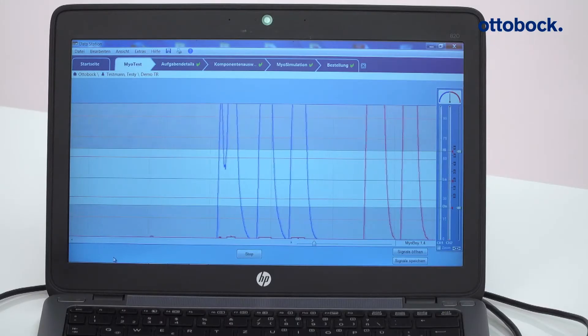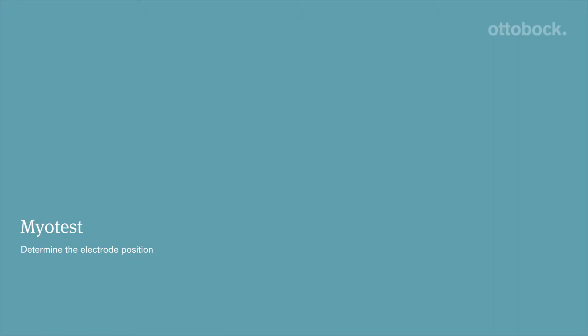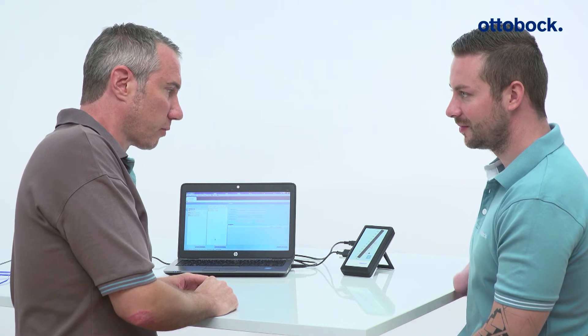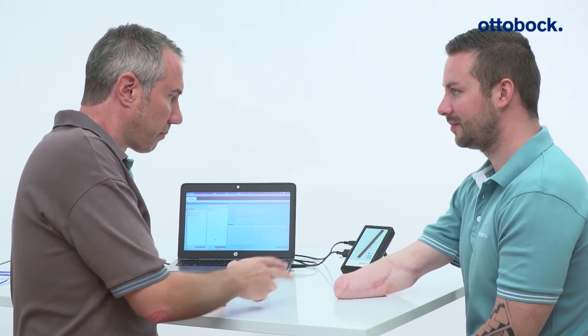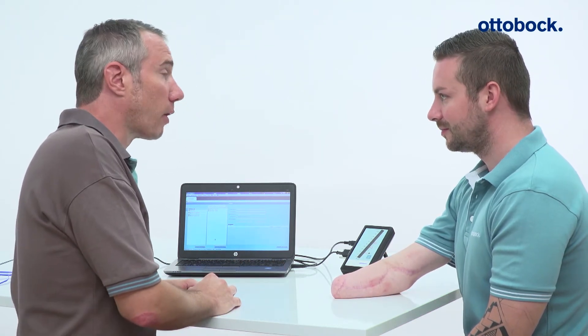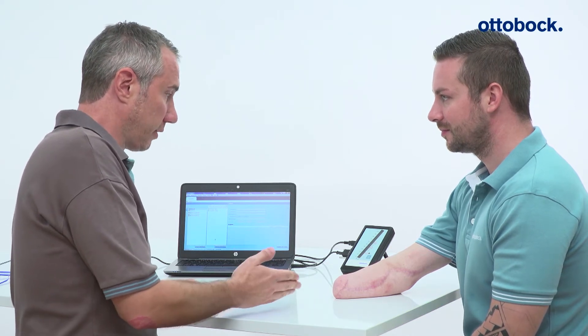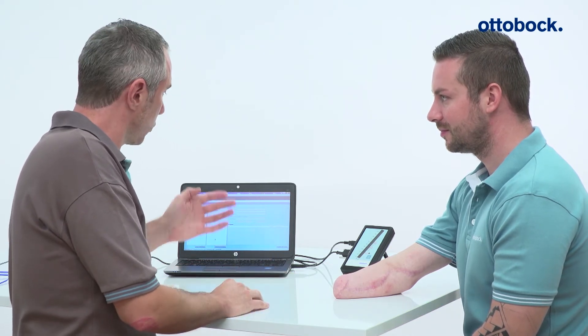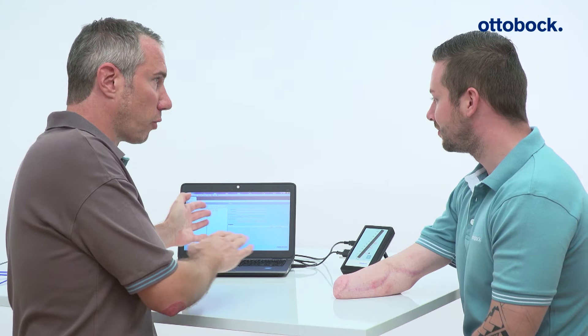Switch on the myoboy and test the connection by touching the contacts of both electrodes. Your preparation is now complete. Before starting the myotest, explain the process to the user and ensure they are comfortable. A careful, accurate evaluation of the myosignal and the corresponding adjustment is essential.